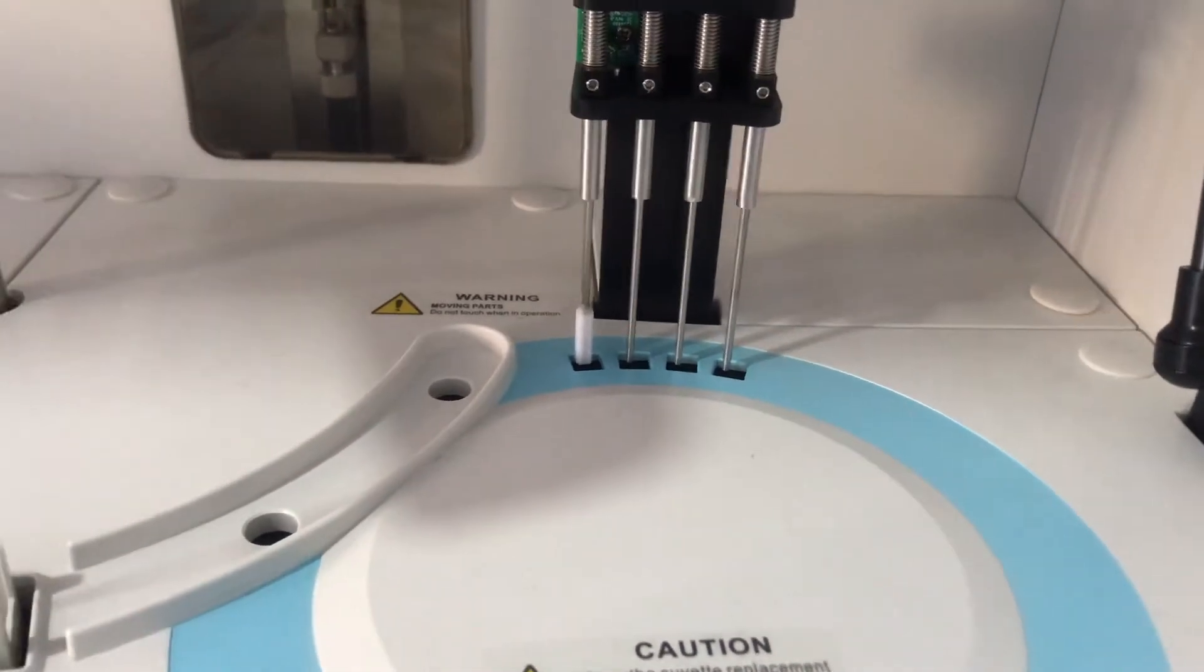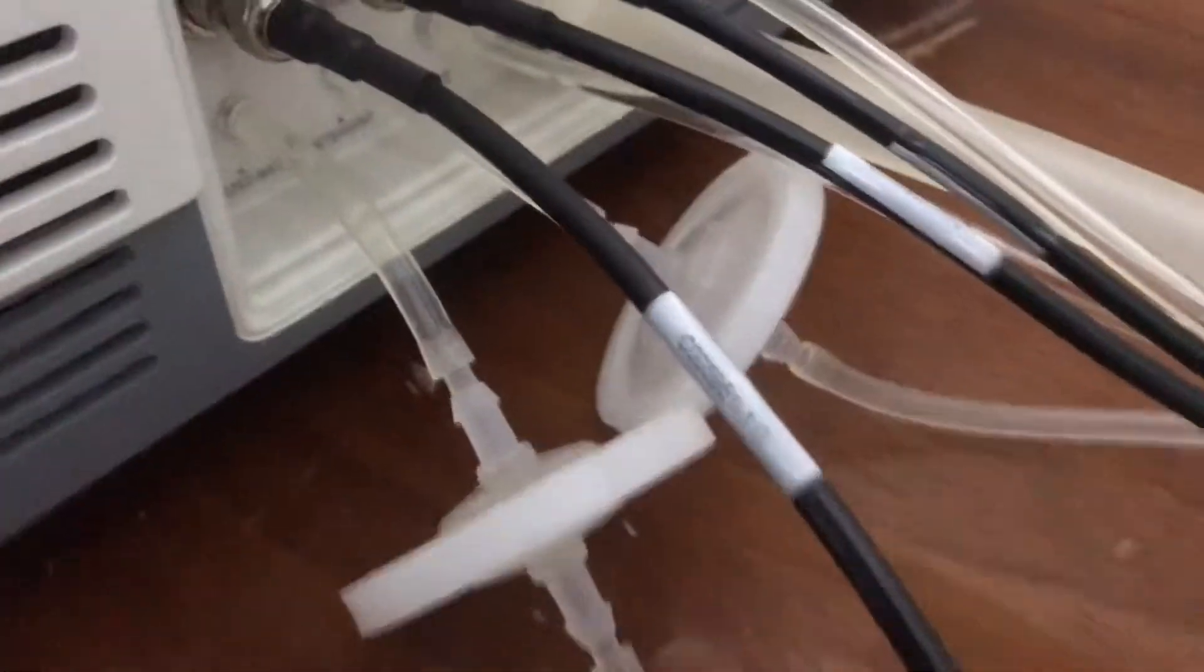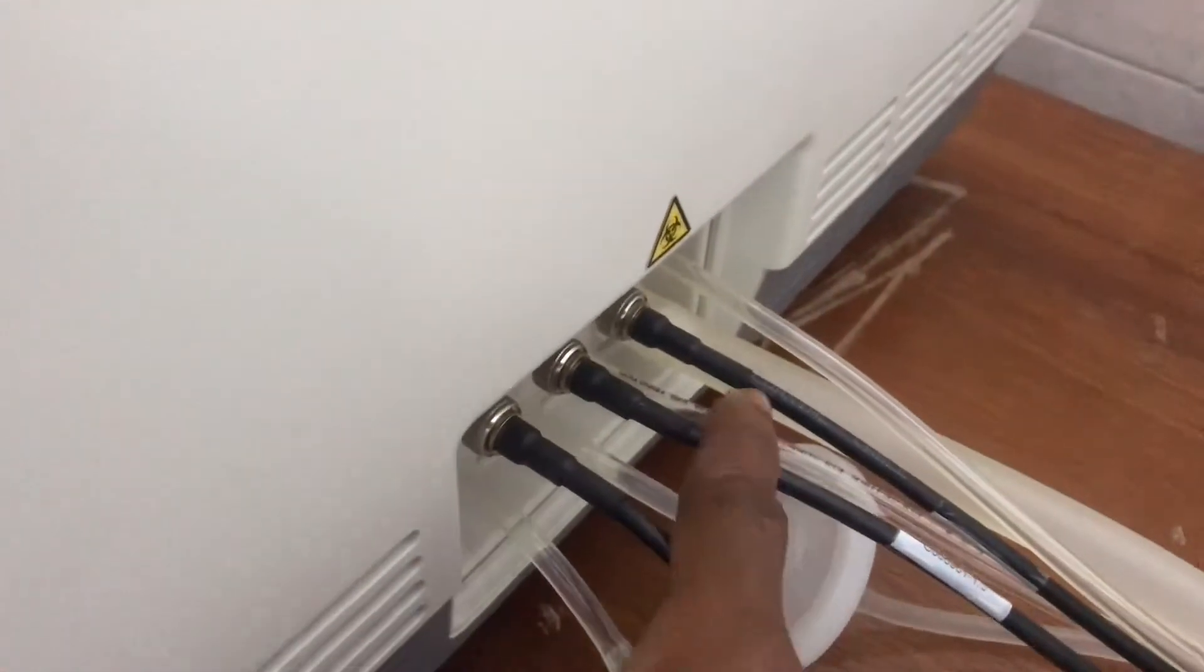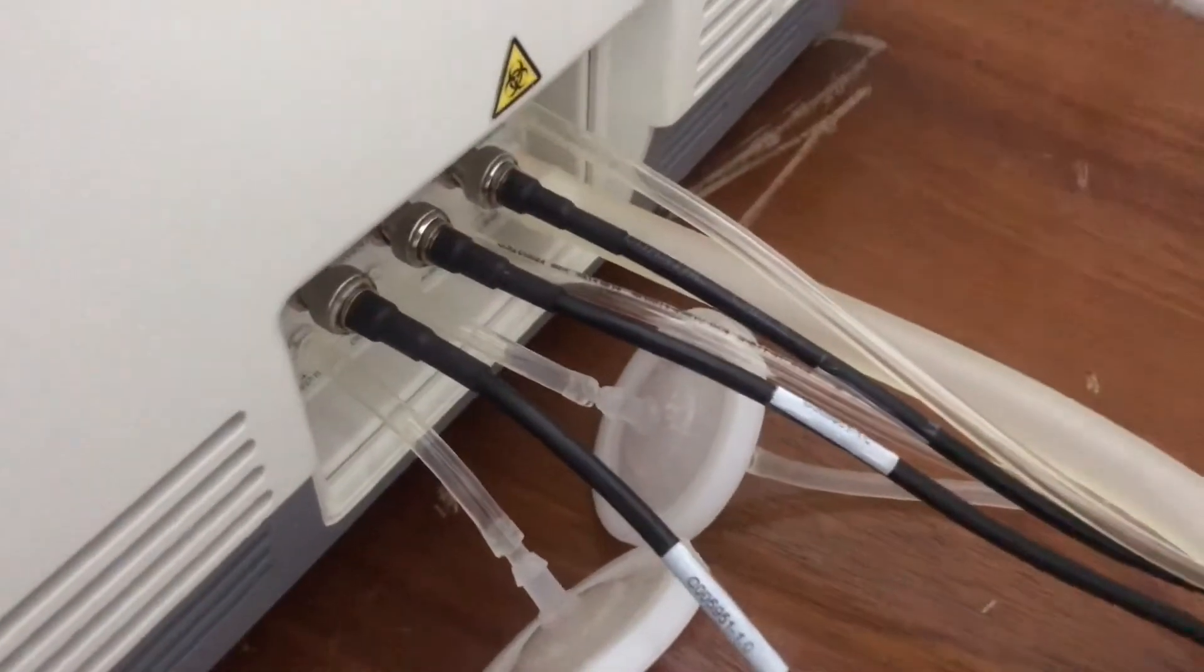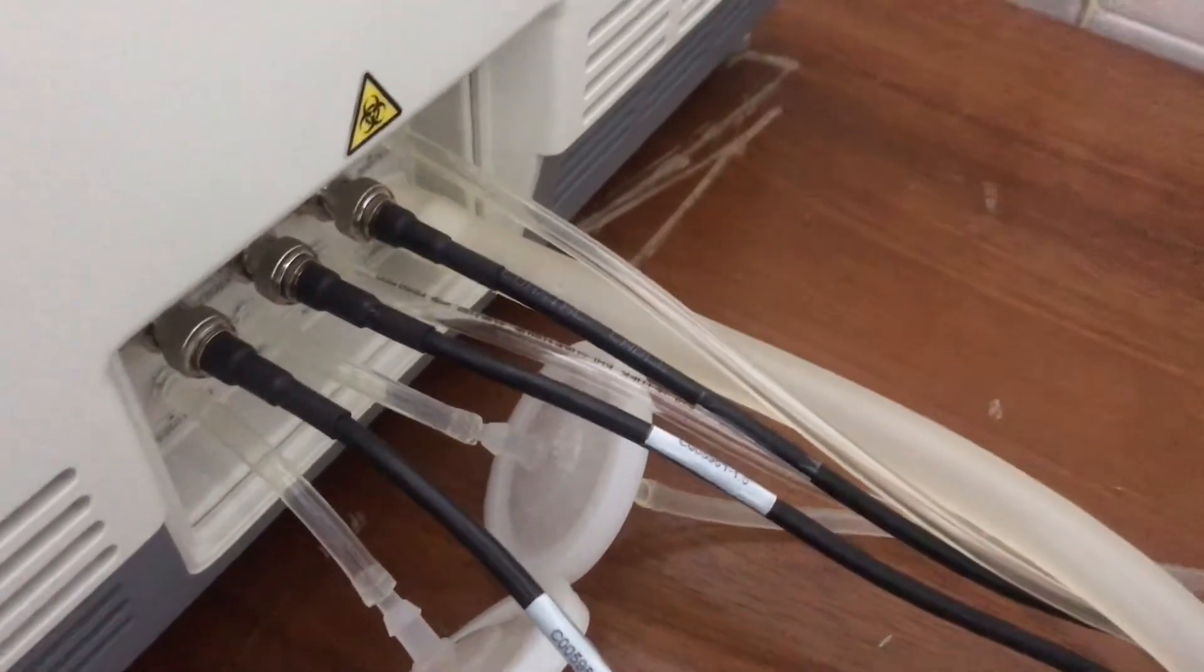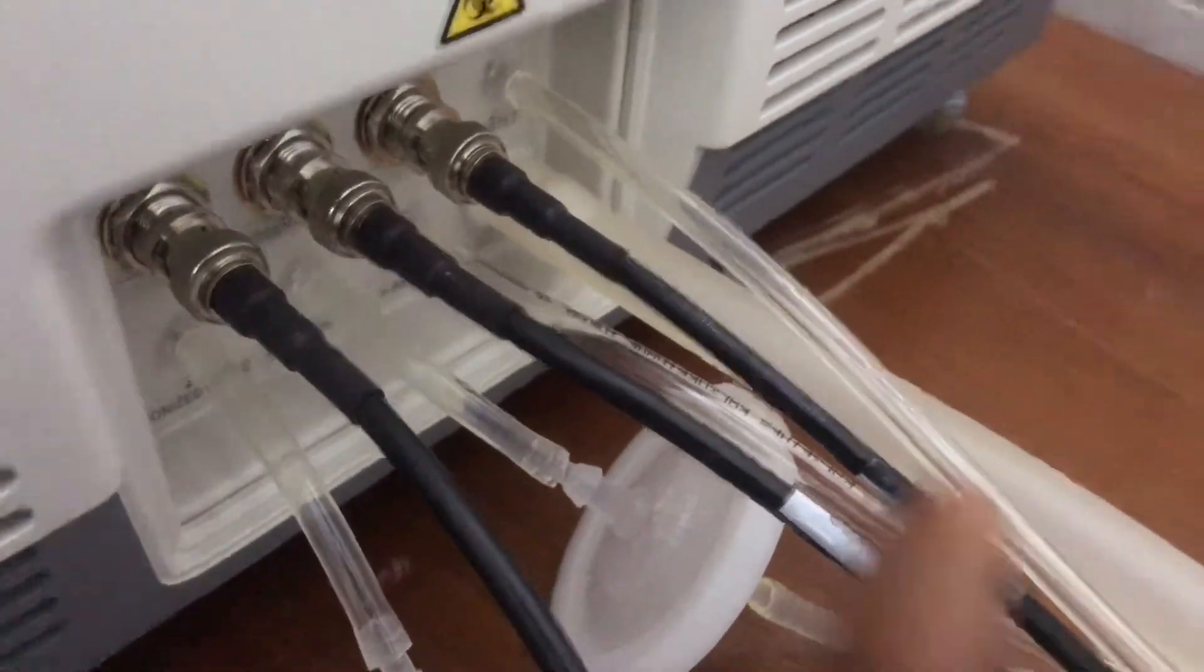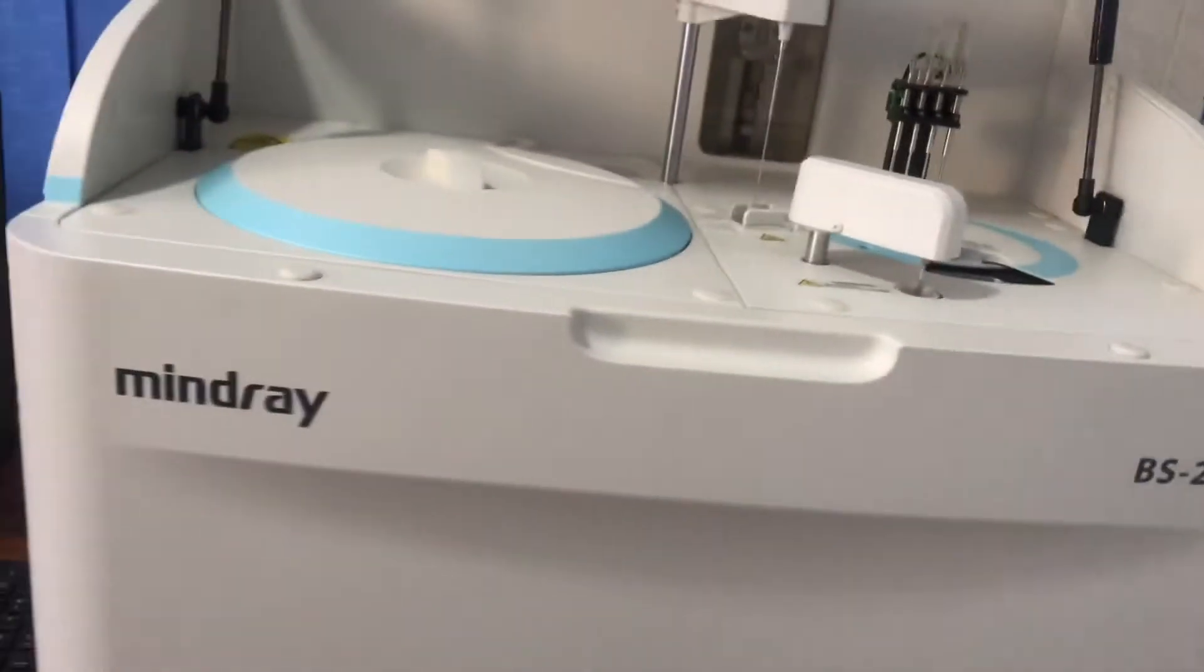It washes the cuvette with CD80 and deionized water which has been connected to two different containers. This is where you have the deionized water coming in, and then we have the CD80 also coming. These are basically sensors that help detect the level of CD80 or the deionized water, so it can tell you when they are in shortage. These are waste tubes. After washing, it will pass through this point and then come into the waste tube.